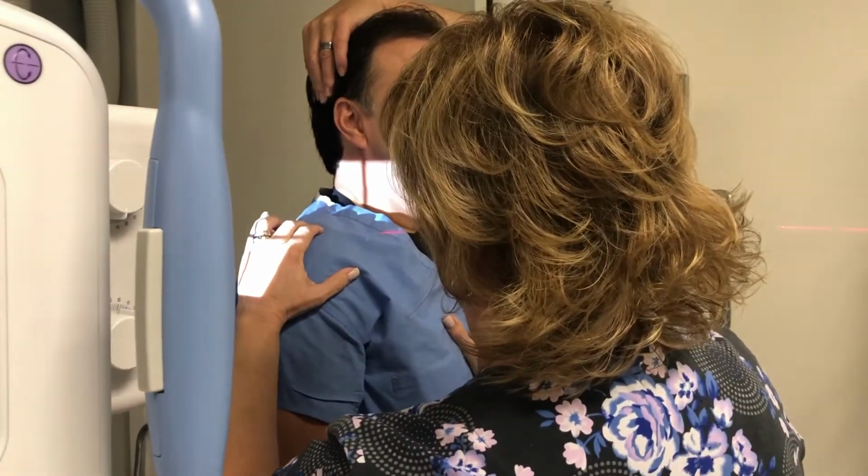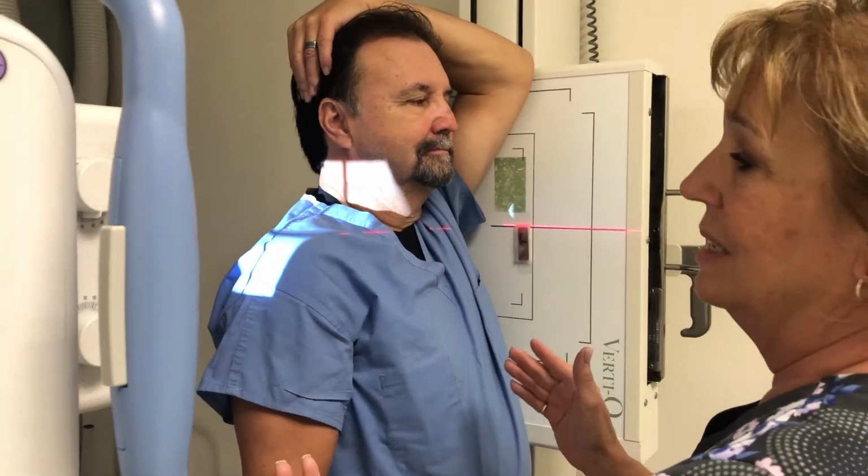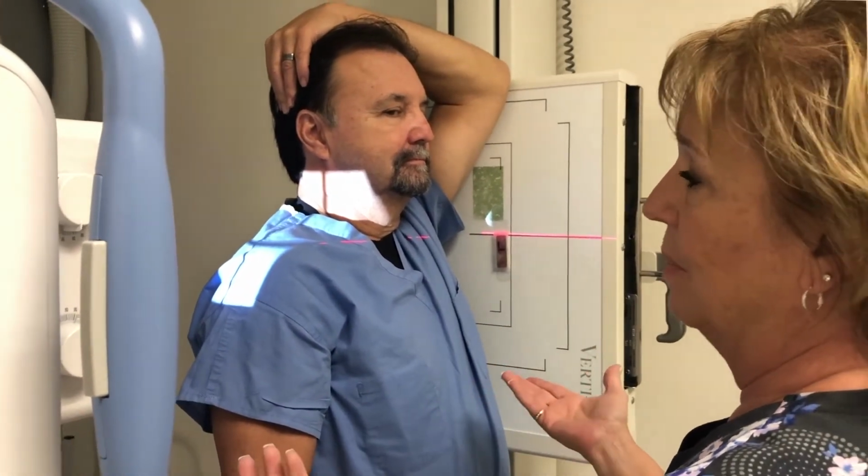So I would leave it open to an 8 by 10. And if you didn't see C7, T1, you could do what they call a swimmer's view.